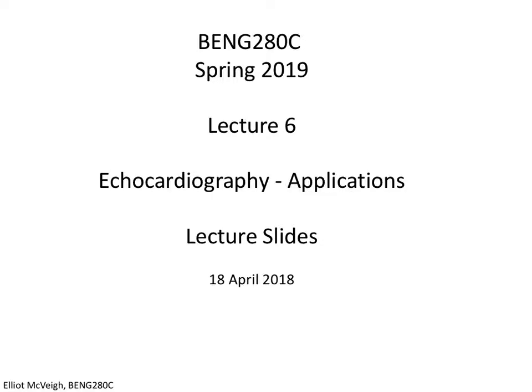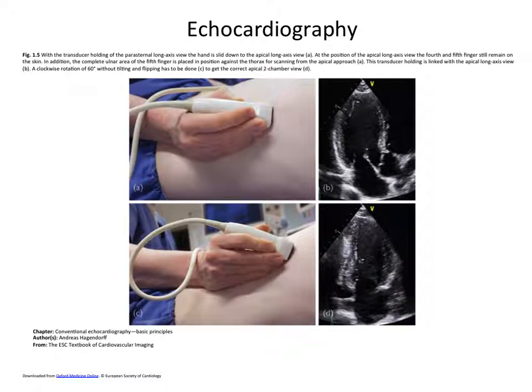So today we're going to look at echocardiography applications. On Tuesday, we looked at basically the physics of ultrasound used to make echocardiographic images. And today we'll look at how that physics plays out to give us some interesting applications. First of all, are there any questions to start with about the lecture on Tuesday, the physics lecture?